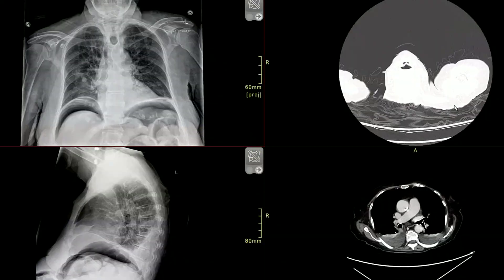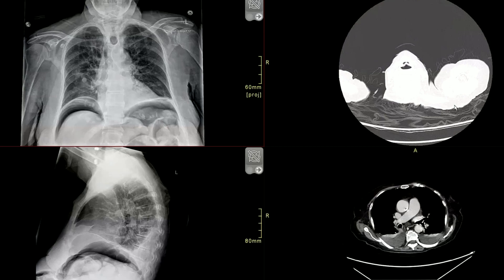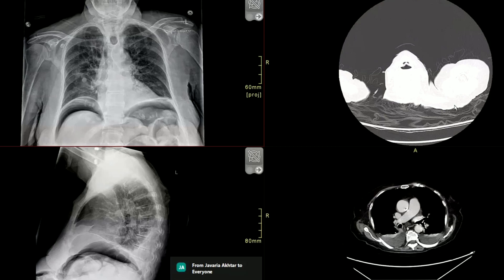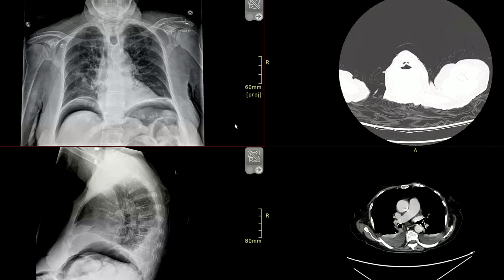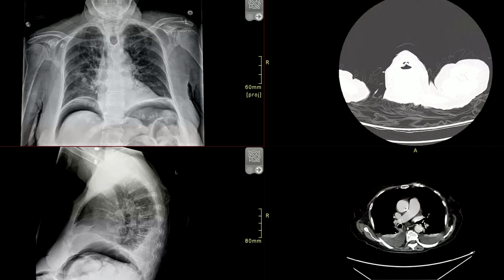Moving on: I am provided with chest X-ray frontal and lateral projections. On the chest X-ray, I can appreciate air lucency under the right hemidiaphragm. This is pneumoperitoneum. The next step would be to urgently call the surgical team and advise a CT of the abdomen.